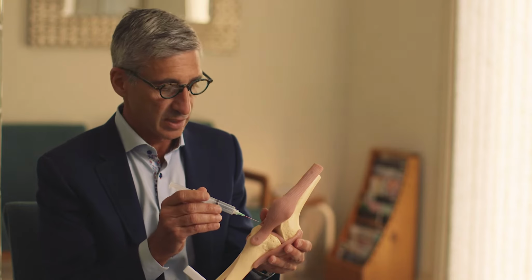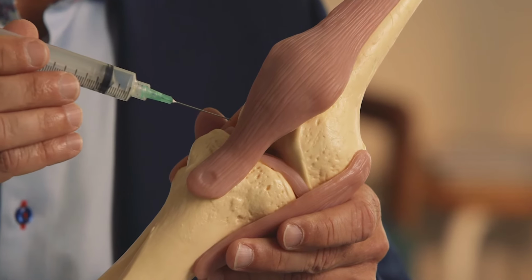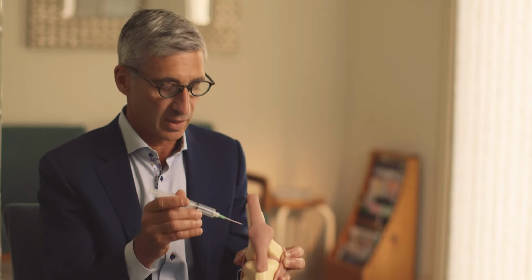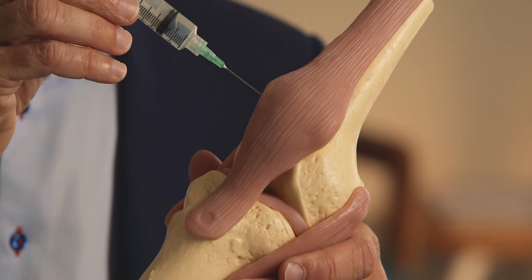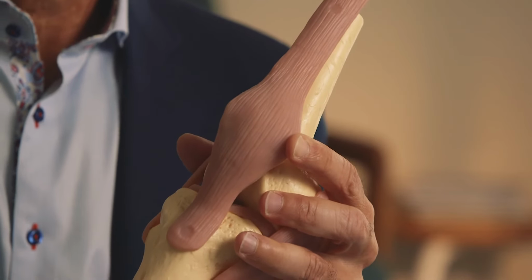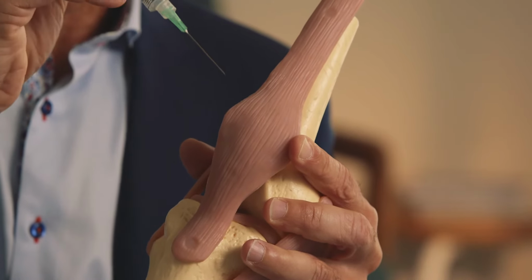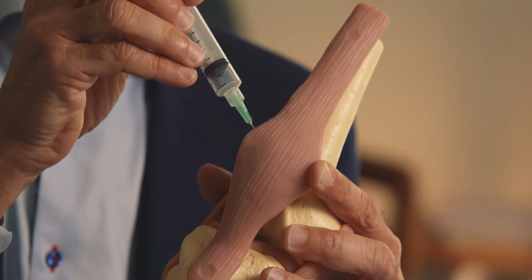The problem with this injection technique is it may involve the fat pad, the anterior cruciate ligament, or the articular cartilage. A more reliable means of injection is to use one of the mid-patellar portals, either lateral or medial, or suprapatellar portals above the patella. I use a modified mid-patellar portal, which has been shown by Jackson to be the most accurate. I inject at the superior pole of the patella with the patella laterally displaced, directing the needle down at a 45 degree angle in the coronal plane, and trying to abut or rest up against the patellar articular cartilage. That way I know I'm in the knee joint.